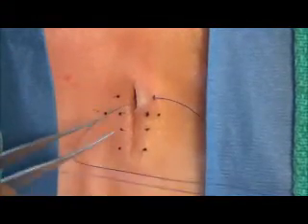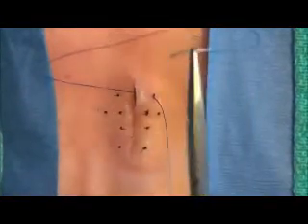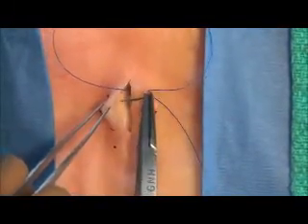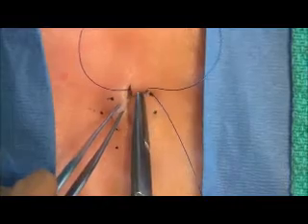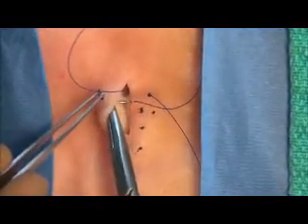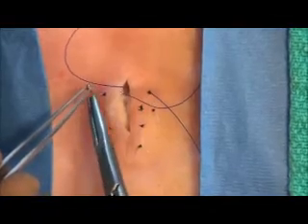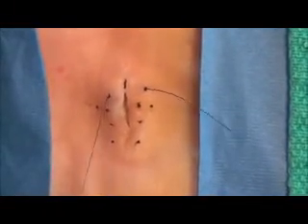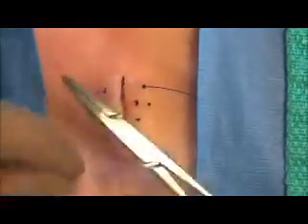into the wound. Reload your needle and enter into the subcutaneous tissue on the left, opposite of where your needle exited on the right. Again, twist your wrist so that the needle exits the skin on the left wound margin, the same distance from the wound as your entry point on the right. Congratulations! You've now placed the simple interrupted suture, which can either be tied by hand or with an instrument tie.